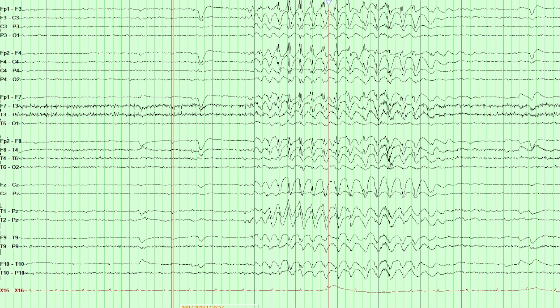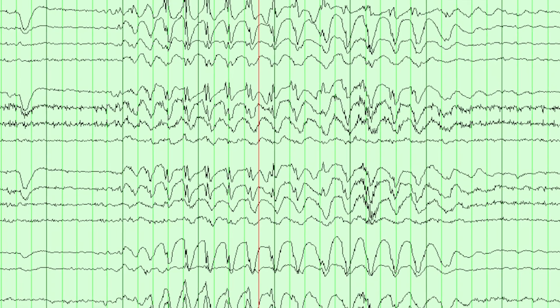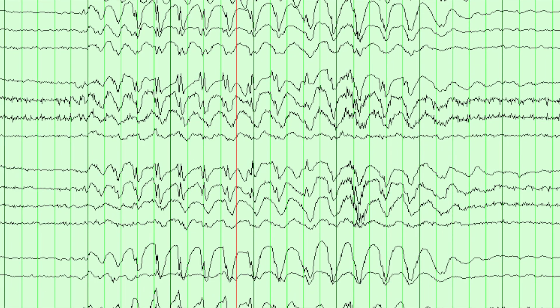This is an EEG with anterior-posterior bipolar montages. The background waves are the alpha waves, and this bunch of waves clearly stands out from the background — this is a characteristic of epileptiform discharge. In this EEG, you can see a typical case of generalized epilepsy. All the sharp waves are followed by the after-coming slow waves. They clearly disturb the background and the majority of the waves are of negative polarity.